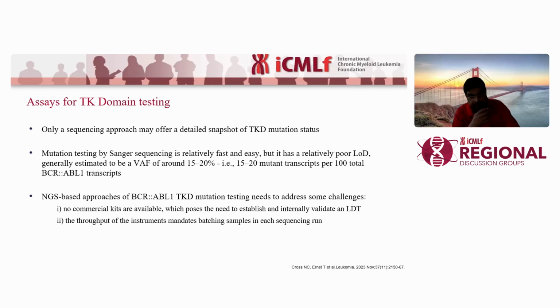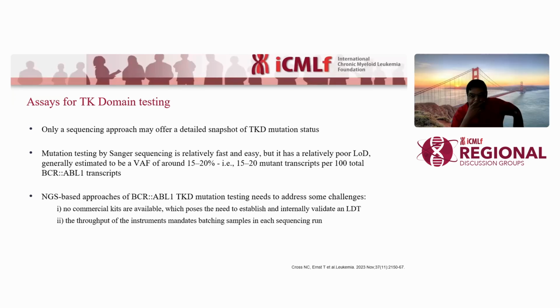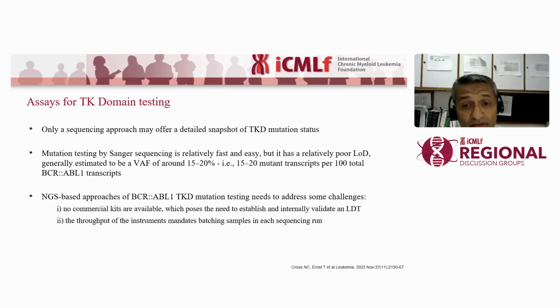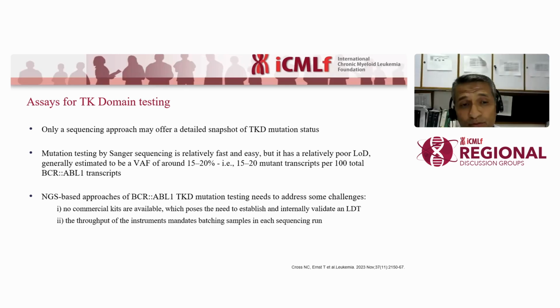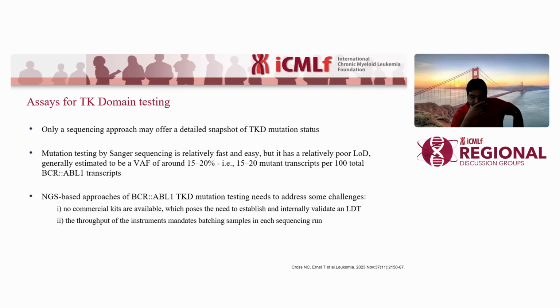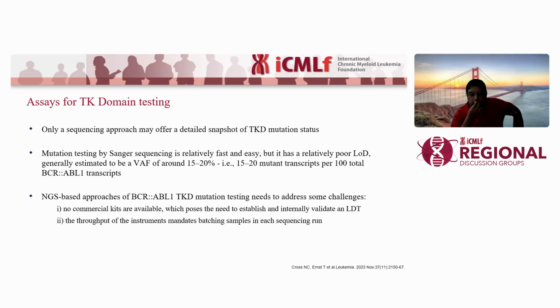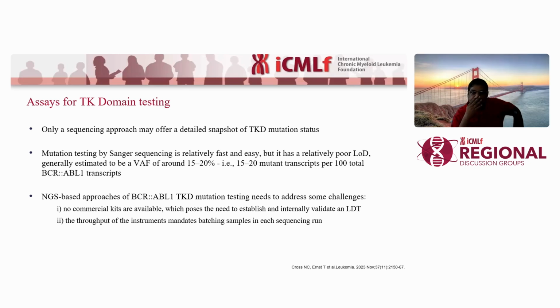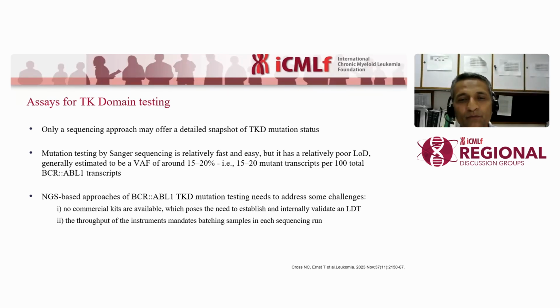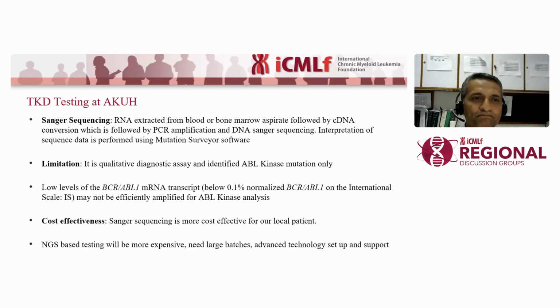But if you are doing a more advanced technique like NGS based testing, it will be very quick. But the challenge is that there is still no commercial kit available for testing by NGS, and we need to establish and internally validate it as a laboratory developed test. Second, the throughput of the instrument mandates large batches to have good cost effectiveness and feasibility of this test.